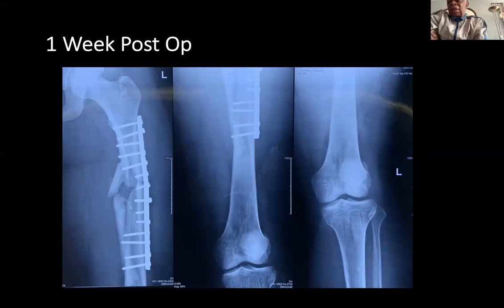Yeah, I see the plate bending at the fracture site with a lateral apex, and I see close to the fracture site some. That's fine. We don't have much time, so the plate started to bend. Would you have done this question? Sorry, there is so much interruption this side that I can't get the question. All right, we can get another person to answer.